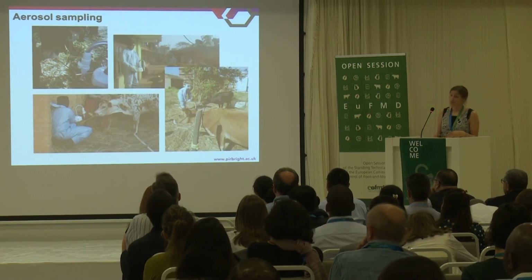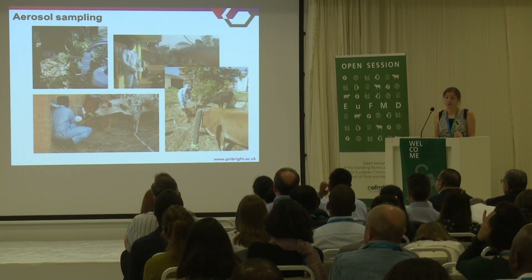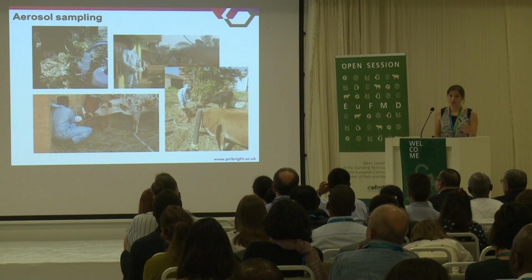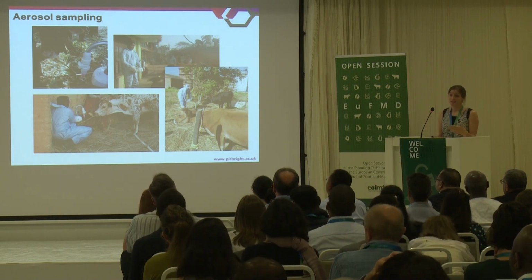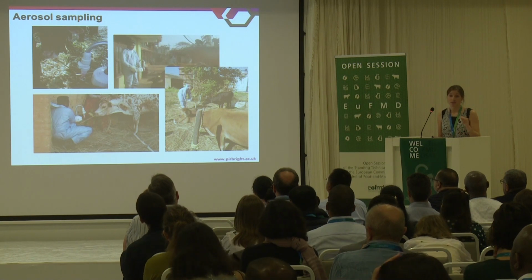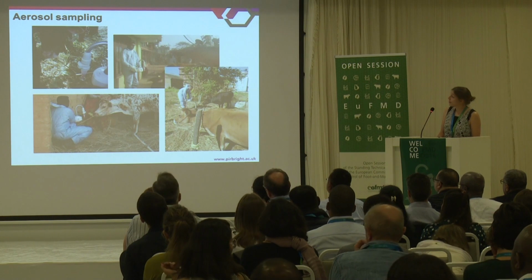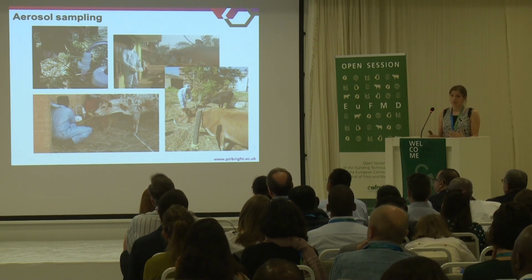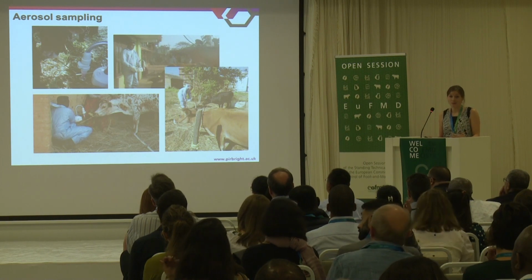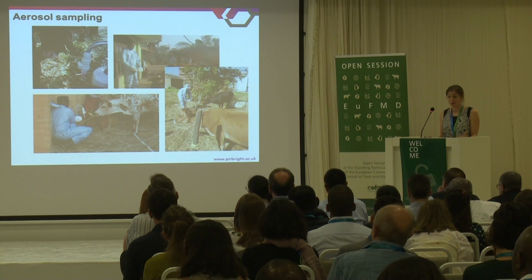At the same time as doing the environmental sampling, we also looked at collecting aerosol samples. The idea behind the environmental sampling and aerosol sampling is that it permits us to take essentially herd level sampling rather than sampling from individual animals. While we were in Nepal, we took various aerosol samples. We know that if you stick an aerosol sampler directly in front of an infected cow, you can detect foot and mouth in those samples.